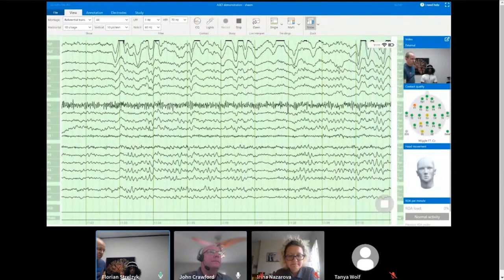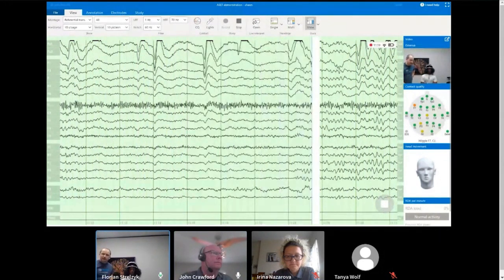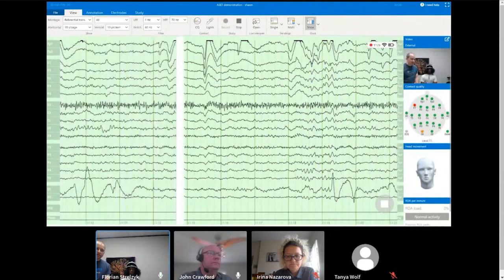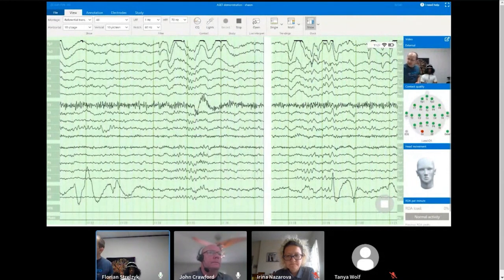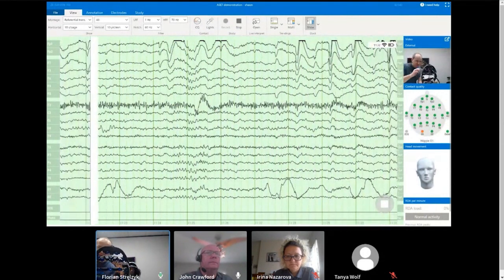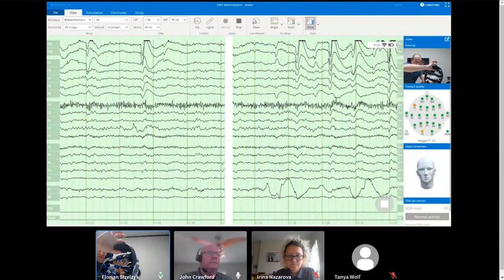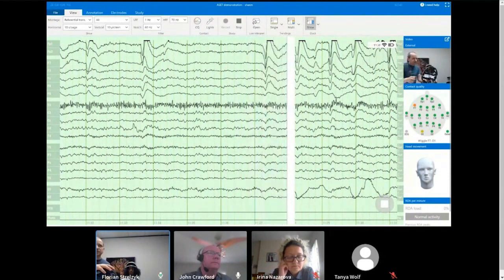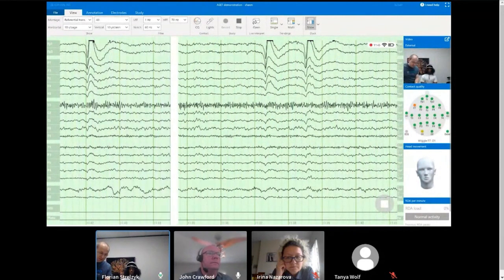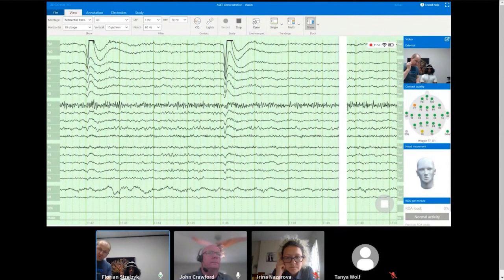Well, for this webinar now, it was easiest to do it sitting up, but no, you can have this slightly reclined. What we recommend is to use a towel roll or a neck pillow to just make sure that the back of the headset does not touch the back of the bed or the chair. So you see here, there is about a good height in the back of the headset. We don't want the headset to be touching anything. So in regular hospitals or reclined positions, you roll up the towel as thick as you need it for the neck to kind of be propped up a little bit.